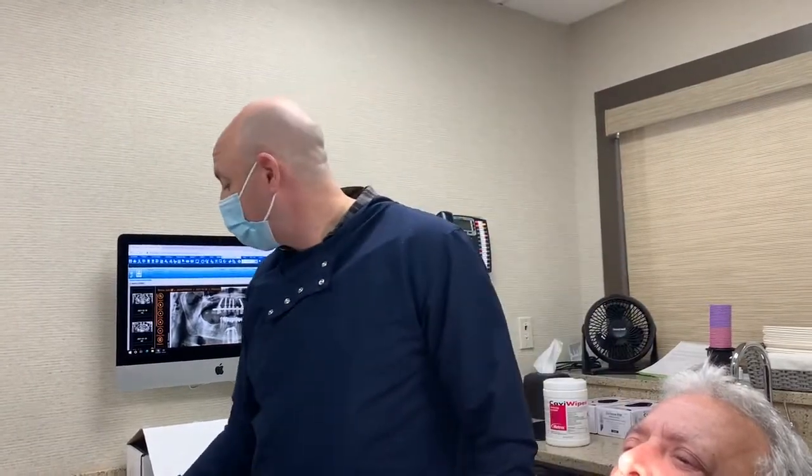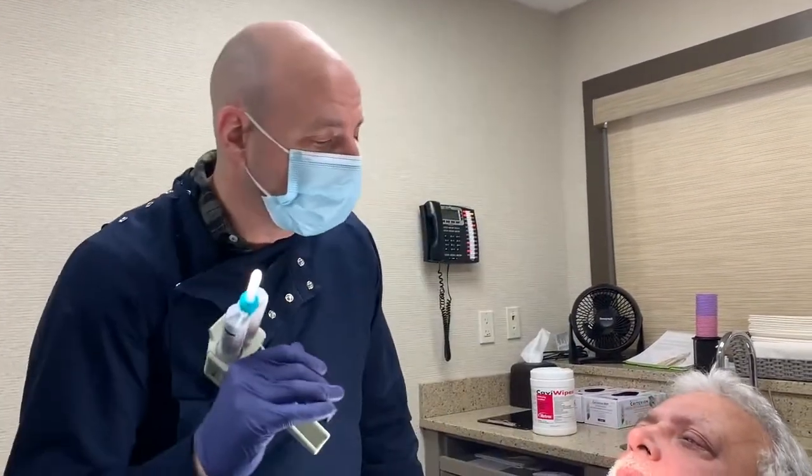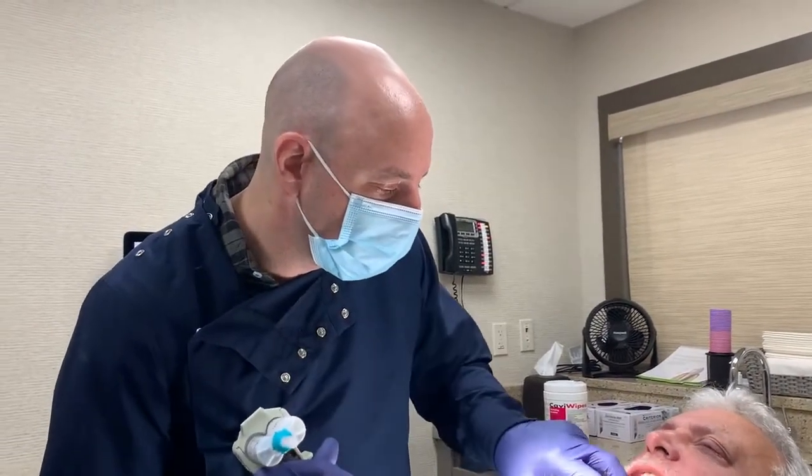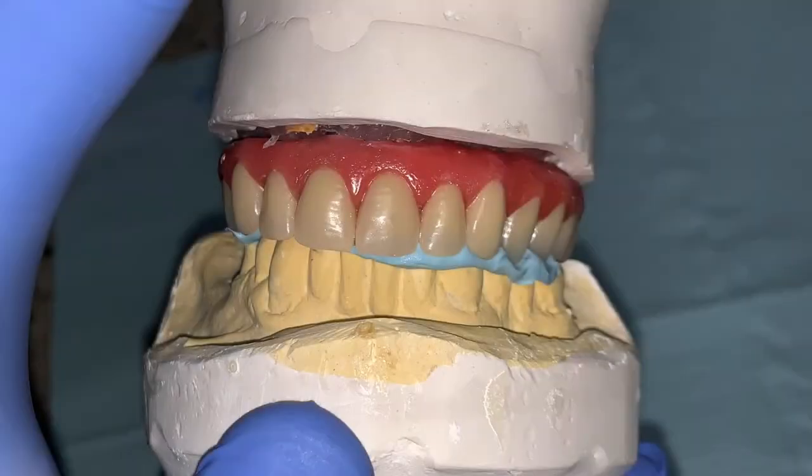Perfect. All right. So, Jack, I'm just going to squirt some goo over your teeth, and you're just going to bite down for me, and bite down for me. Practice biting. Good. And open.